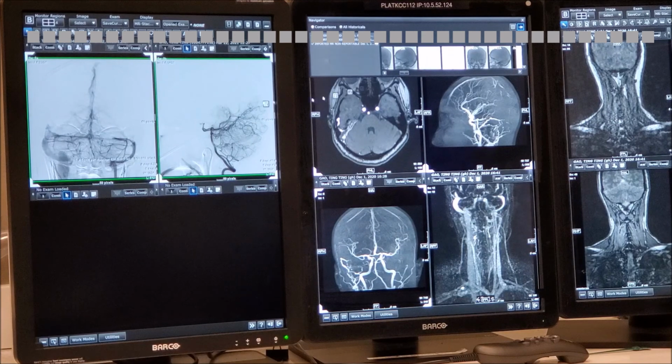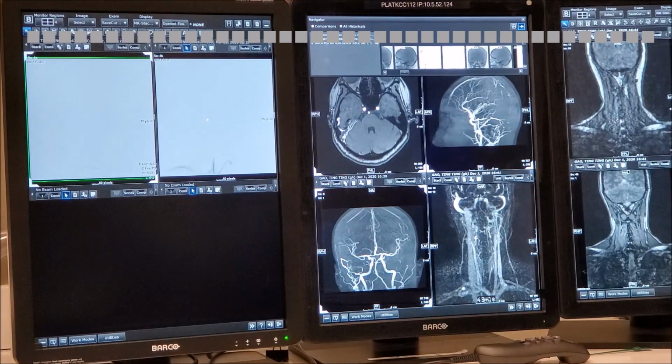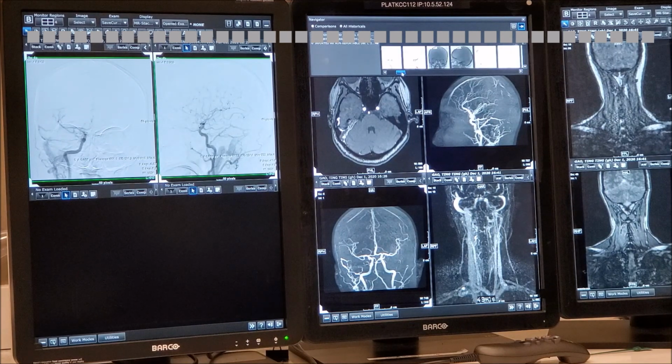Now we go into the right common carotid artery. The right common carotid artery already tells you, although this picture is no more informative than this picture. So we're going to need to do better than this, right? Now, one thing that I've always been fascinated by: how old is she? She's in her 40s.